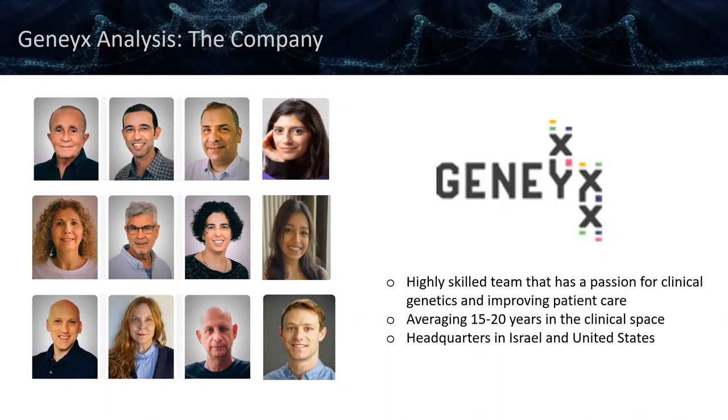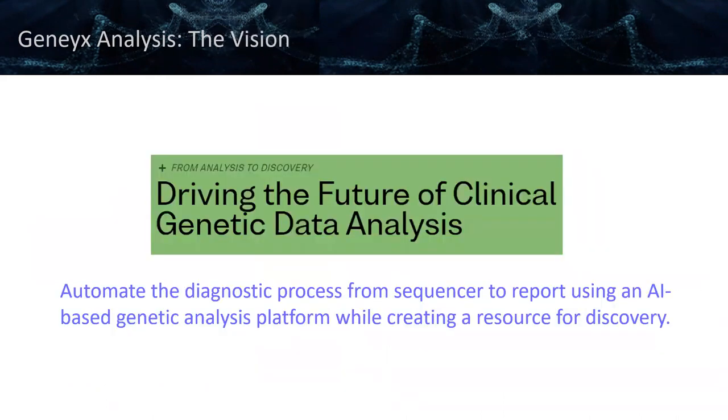With the highly skilled individuals on this team, what we're really trying to do is implement our vision for a clinical genetic software, and drive the future of clinical genetic data analysis. Ultimately, we're trying to automate the diagnostic process from sequencer to report using machine learning, as well as an AI-based genetic analysis platform.